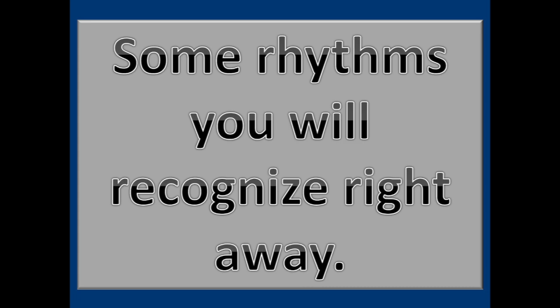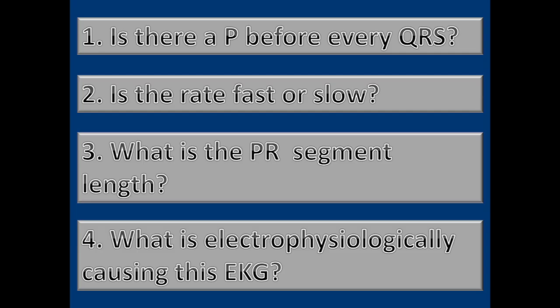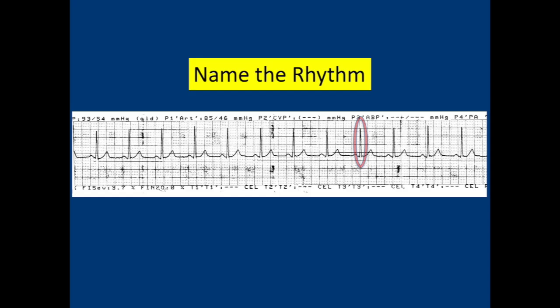Some rhythms you're going to recognize right away. Some you're going to have to look through, ask your 4 questions, and analyze what is going on with that rhythm and what is causing it. And there are your 4 questions again. So let's go ahead and name this rhythm. This is one that you should recognize.